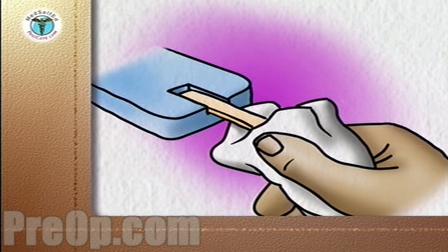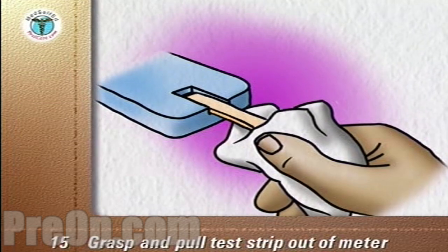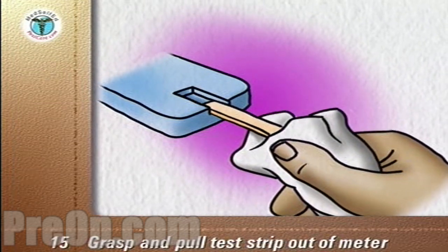Once the blood sugar reading on the meter is complete, use the tissue to grasp the test strip and pull it out of the meter. This usually turns the meter off.